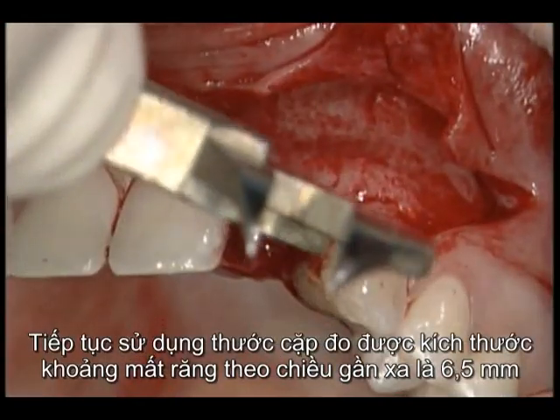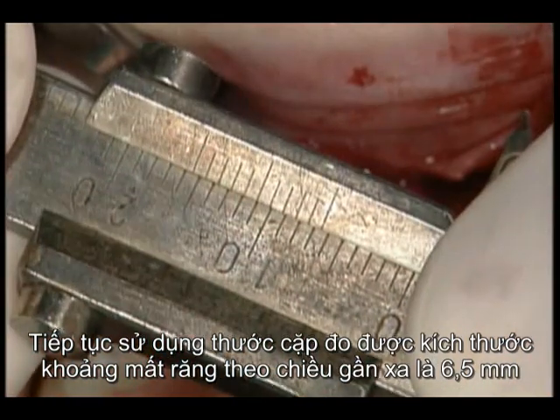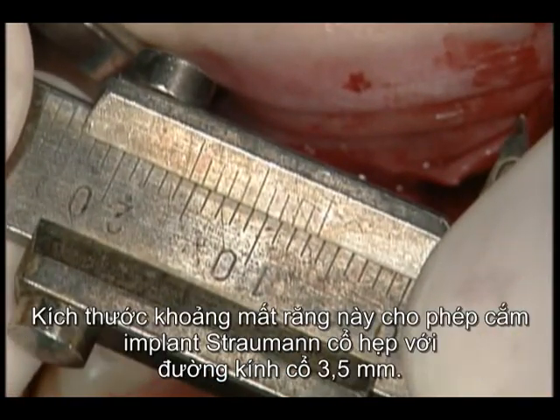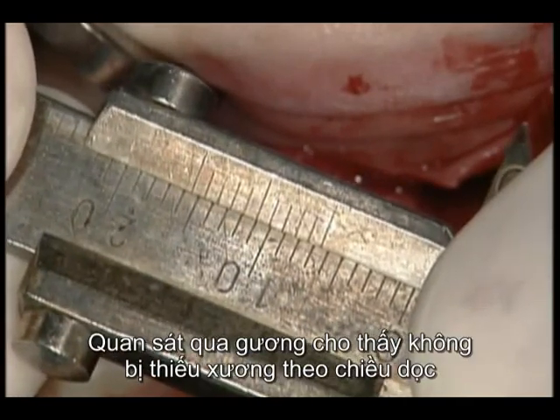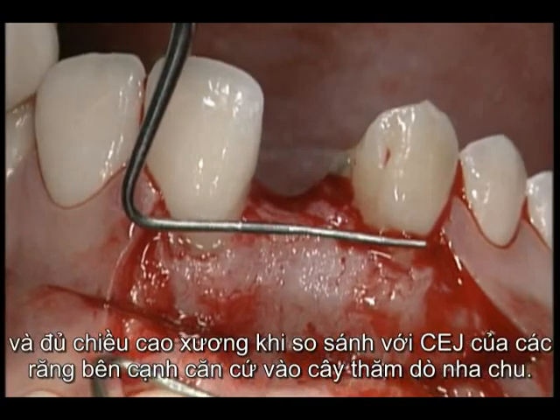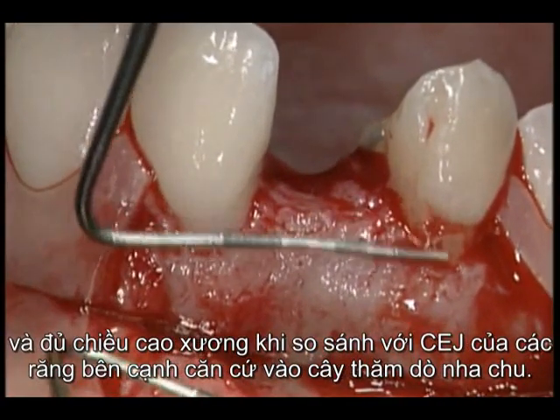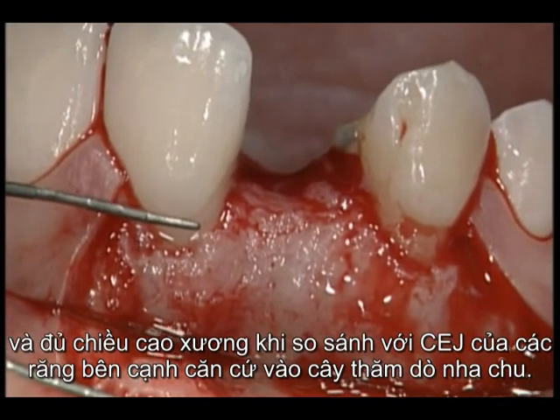Using the same pair of calipers, the mesiodistal gap size measures 6.5 millimeters. This gap size requires a Straumann narrow neck implant with a 3.5 millimeter neck diameter. The mirror view demonstrates no vertical bone deficiency and sufficient bone height when compared to the CEJ of the adjacent teeth, shown by the periodontal probe.